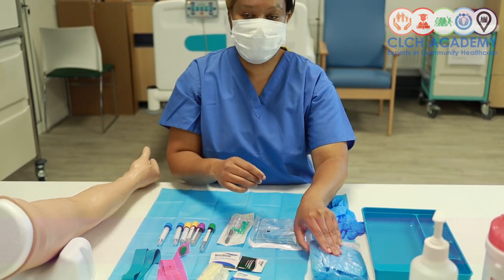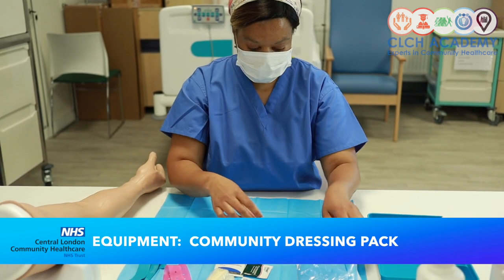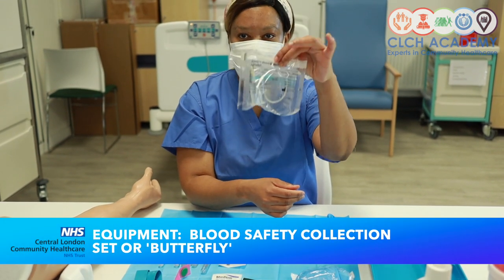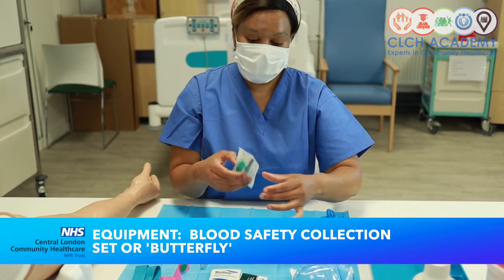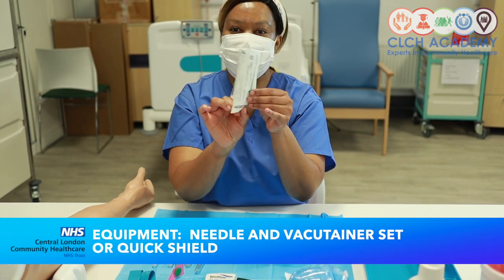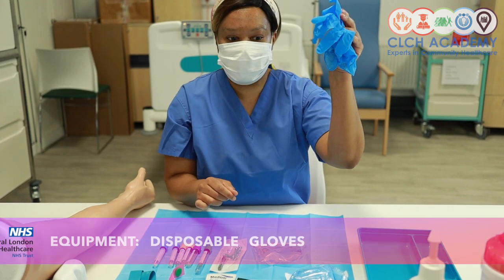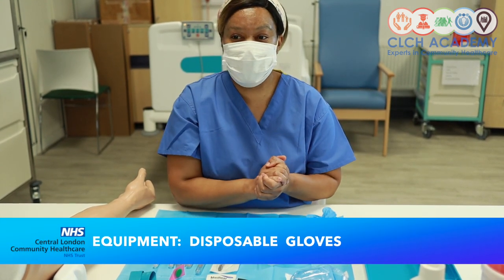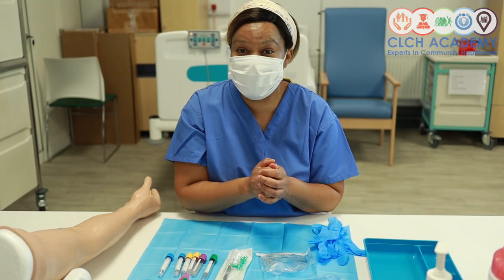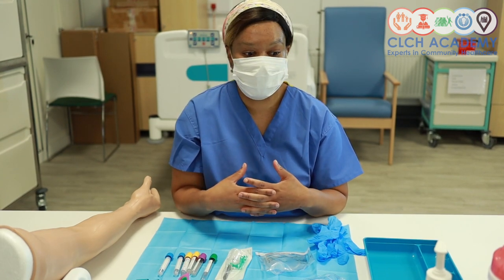You will also need a community dressing pack. Obviously, your blood safety collection set, typically known as the butterfly. And your needle and vacutainer set, commonly referred to, or according to this one, it's called the Quick Shield. A pair of gloves. I also have a pair of gloves within my community set, and that will support the ANTT practice that we will be working through today as part of the process for venipuncture.